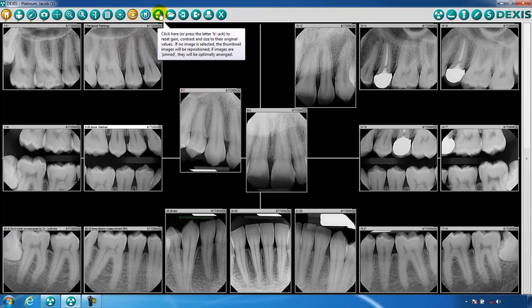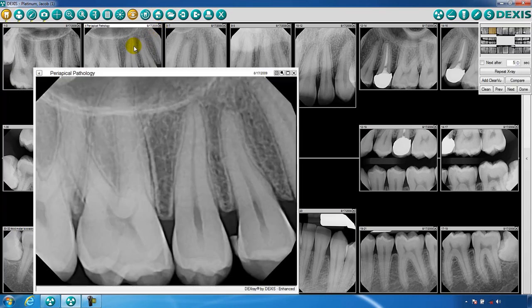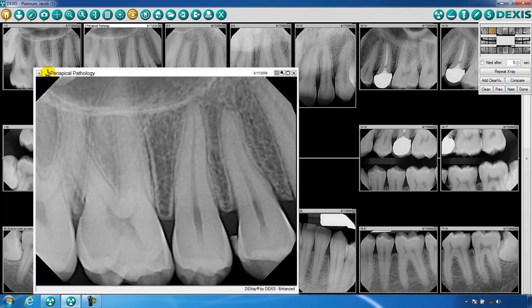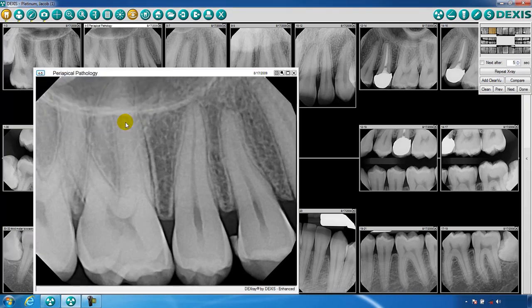Each image will display with a tooth number and date. This information may be modified by clicking on the tooth number and changing the tooth. You may only change the date on an image if it has been imported from another source.